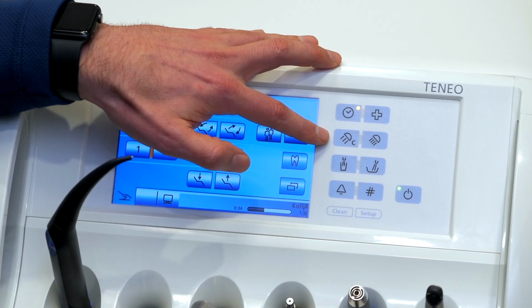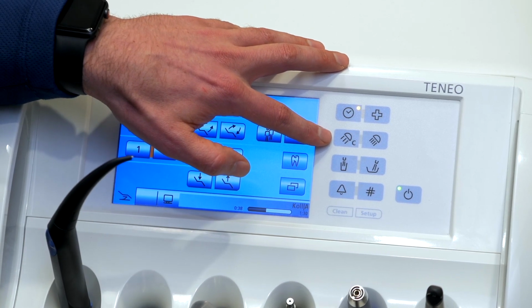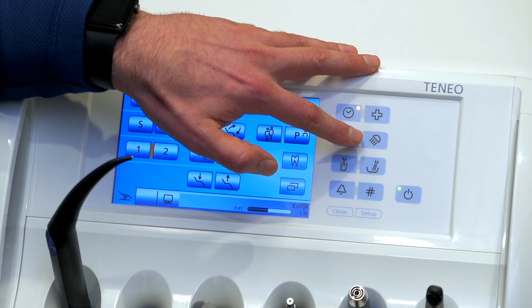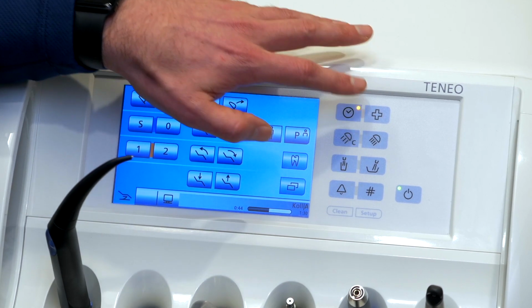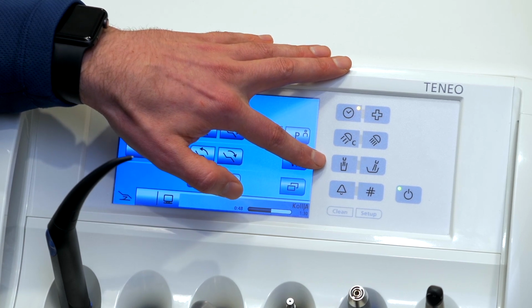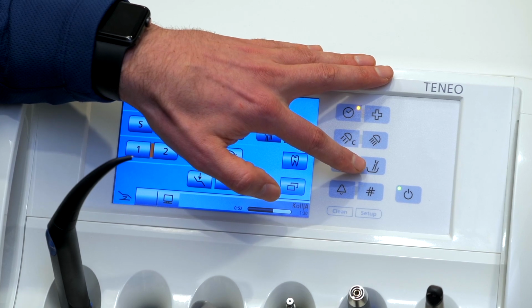Our next row of buttons, we have the light buttons. The one on the left is to activate composite mode, and the one on the right is on/off for the light itself. The next row of keys are cuspidor related. So you have your cup filler and your bowl rinse here. Those only apply if you have a cuspidor equipped on your Teneo unit.